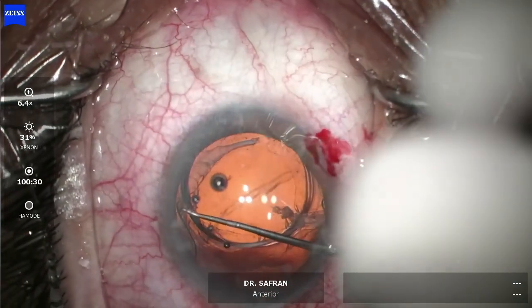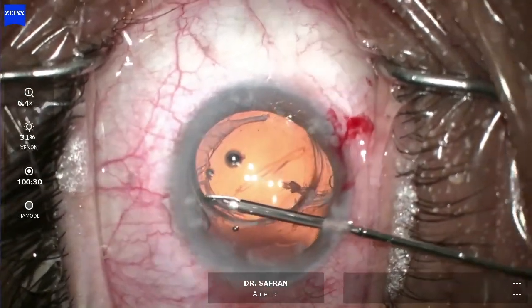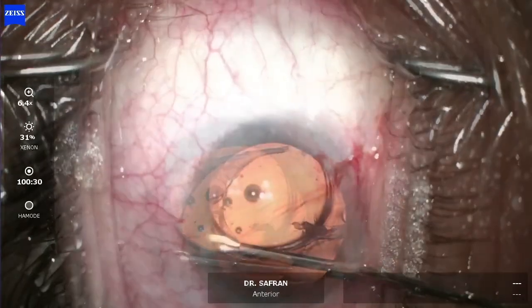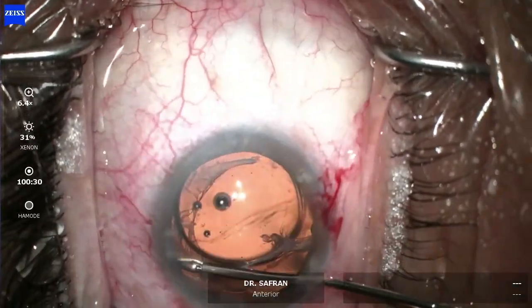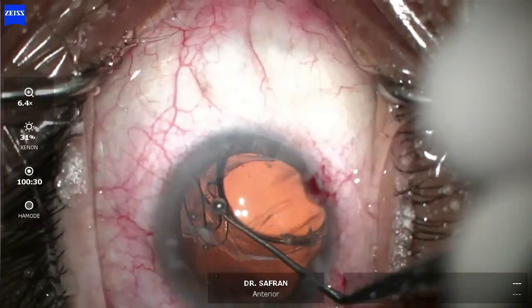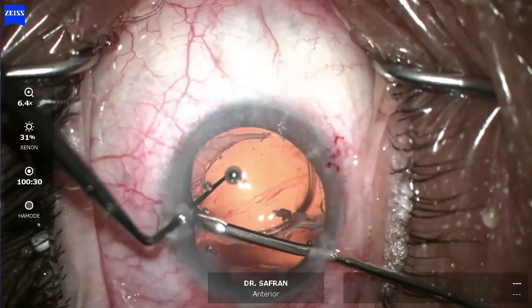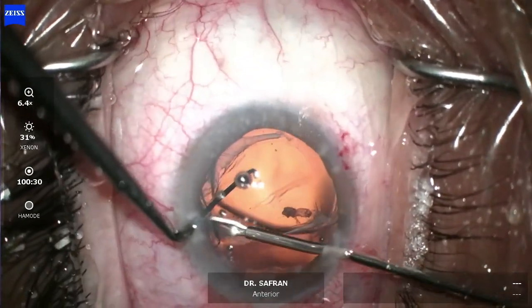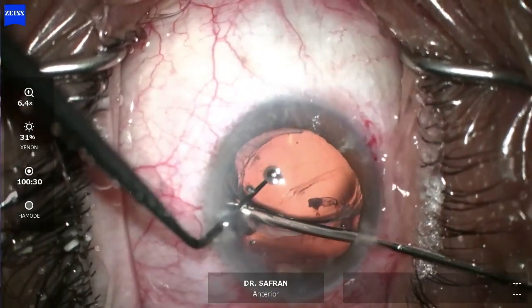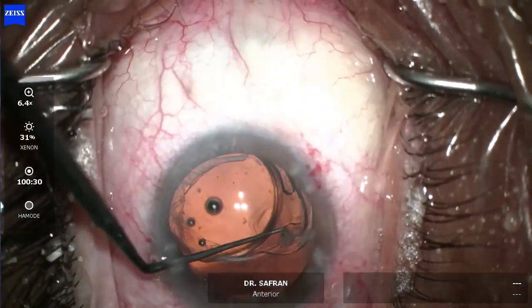Now I'm going to try to mobilize this haptic, but the haptics of this lens have a double prong, and fibrosis tends to go through this opening, making it very difficult to mobilize. If you just pull on it, you'll just tear the bag. So I'm trying to cut it with a 23-gauge scissor, but there's still a little area of fibrosis growing through this double-pronged haptic tethering it in place. I push down on the lens with the Sinski hook to create some space between the anterior capsule and the haptic to reach in with a 23-gauge micro scissor. I cut that fibrosis and right there I can feel that I've snipped it.